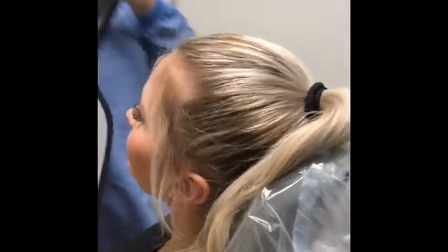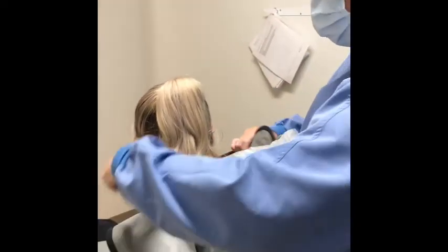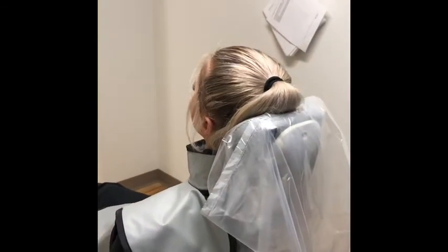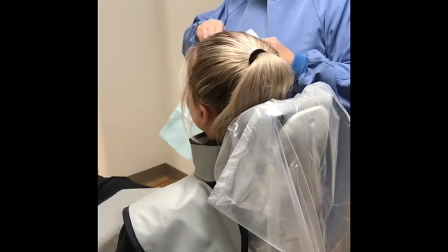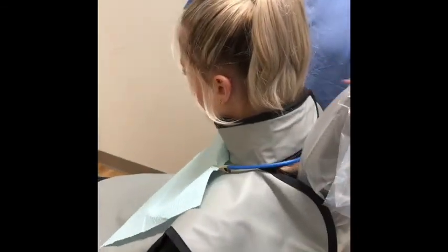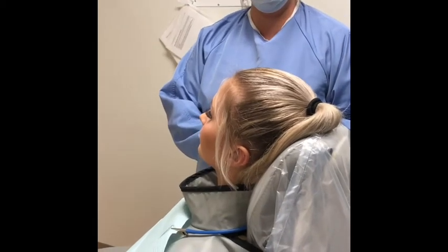So once you have that, we can go ahead and put our lead apron over hers, and we're going to go ahead and secure the thyroid collar behind the neck right there, and then we will put our patient napkin, the plastic side, against the lead apron and get that secured over our patient here as well. Okay, and then now we would be ready to go expose our radiographs.